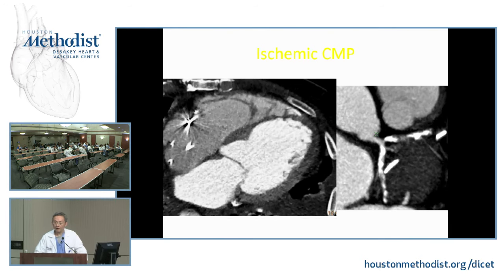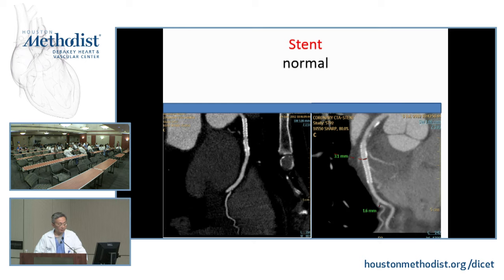Two follow-up questions. One is, in the experience since we had the dual scanner, how many non-diagnostic tests have we had? Meaning there are areas where I really couldn't see because of heavy calcifications. We have to be honest with ourselves as to how often that happens. If it happens 0%, I would be a little concerned.